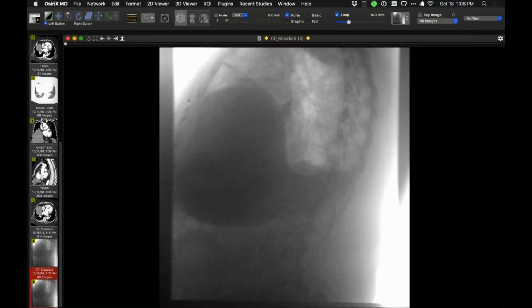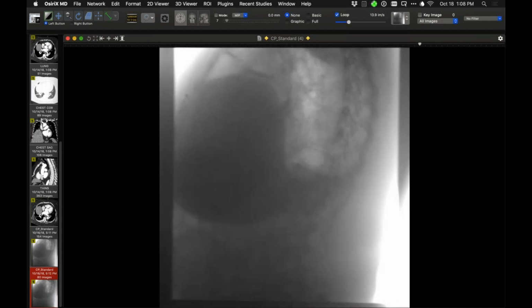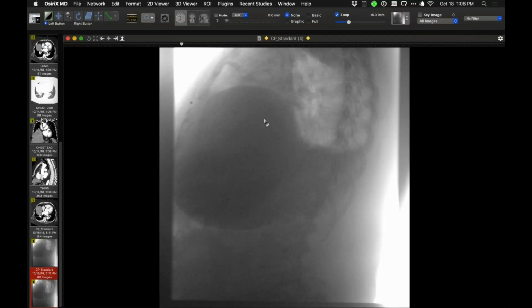This is going to be the sniff, so I'm going to put my cursor here where the dome of that right elevated hemidiaphragm is as it plays, so that you can see whether there is paradoxical elevation of the anterior portion relative to my cursor, whereas the posterior portion goes down. So up in front and down below. Boom. One more sniff coming up, like that. So I think the finding is pretty typical of eventration. Yes, there's paradoxical elevation of the anterior portion, but there is appropriate motion of the posterior portion. So that kind of up and down that we've seen before.